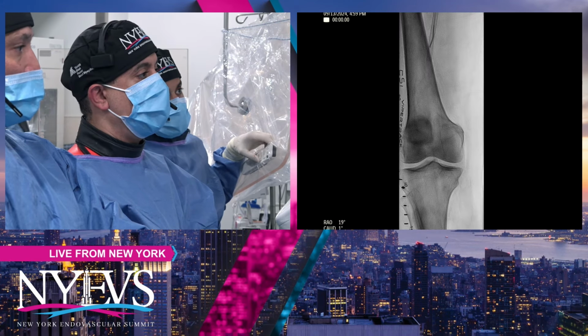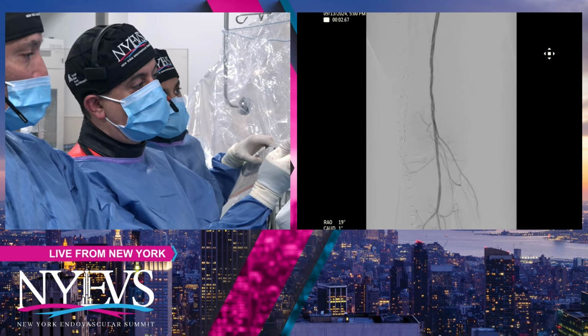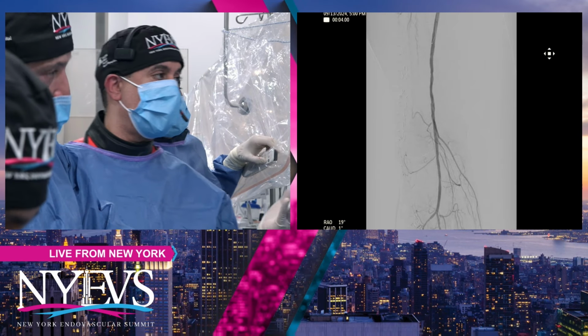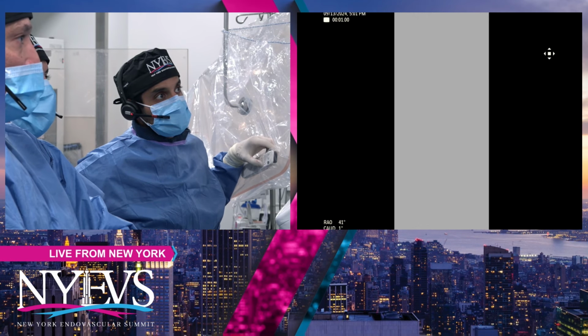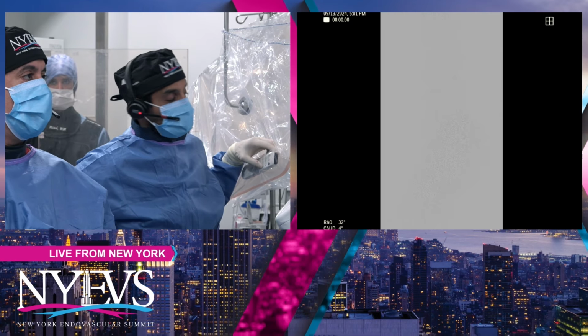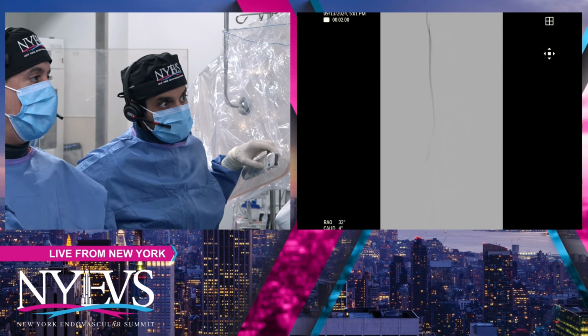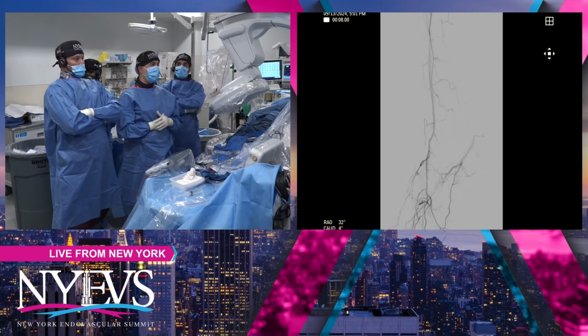And then distally, which was the main concern for the thrombus and everything, we have good blood flow all the way down. Like George was talking about, we don't want to start chasing our own tail. We end up in more trouble. But I think the flow distally right there was good. And that's the AT going down all the way to the foot with excellent reconstitution back to the complete arch.